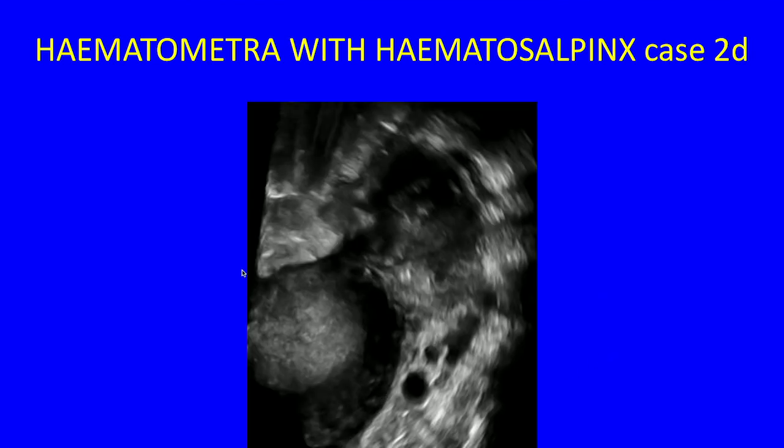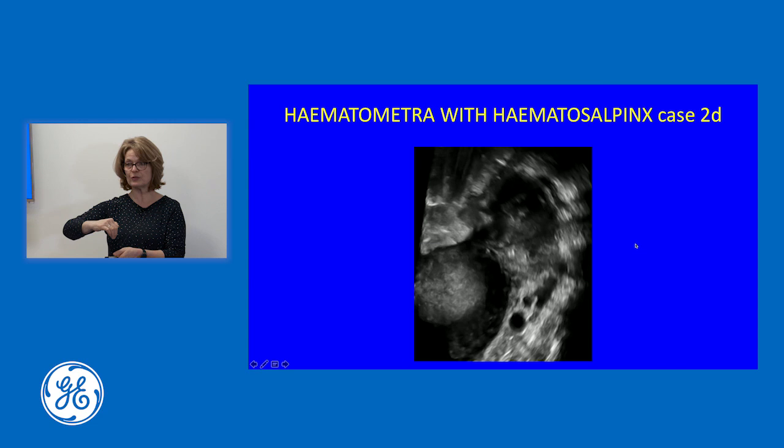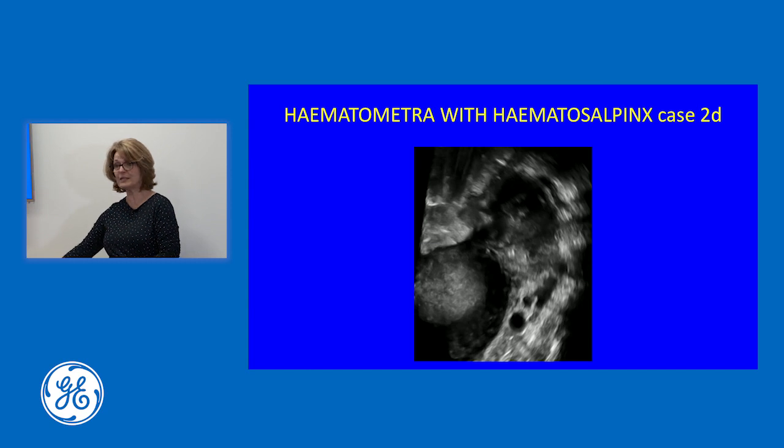So this was her uterus, there is the hematometra, and the blood is going up into her fallopian tube because she has dense myometrial adhesions below. So now she's menstruating again, the blood's got nowhere to go but up and out. And that's exactly what it was. She had a hematometra and a hematosalpinx, and it was all benign. So that was good to know.